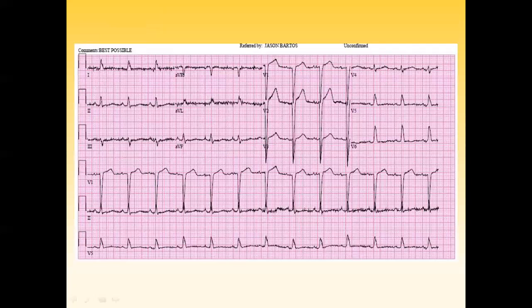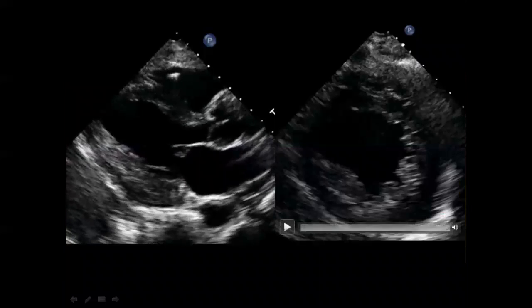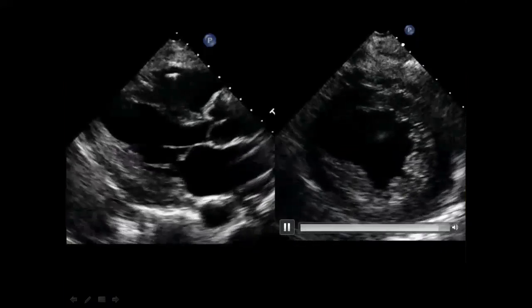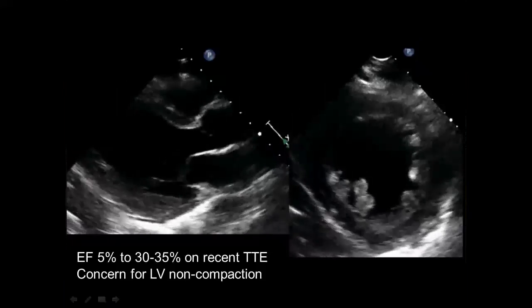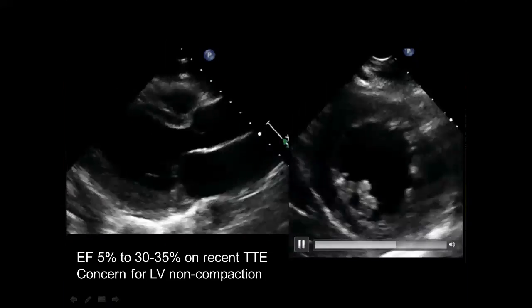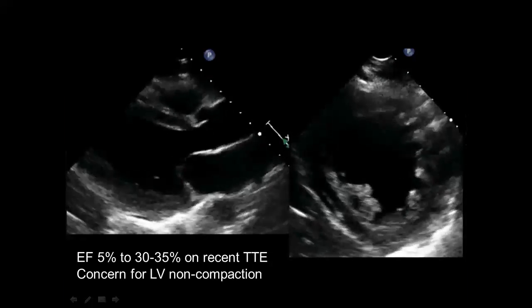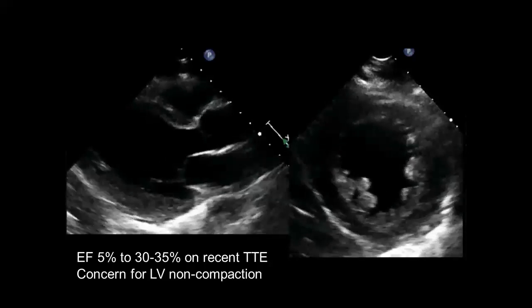This is her most recent EKG. Her echo is actually quite interesting. We don't exactly know for sure what it is. This is the initial one. But the thing that's known right away is thick. She got very thick walls. She got more function back, but still very thick. Trabeculation is very prominent. There's concern for LV noncompaction. So, she had no coronary disease. Did she have an underlying cardiomyopathy that she didn't even know about that kicked off the VF? Why it was so resistant, it's hard to say, but it broke eventually. So again, only because we could do things that, and as a last-ditch effort, I mean, everything else was tried first, but try to give her every shot.